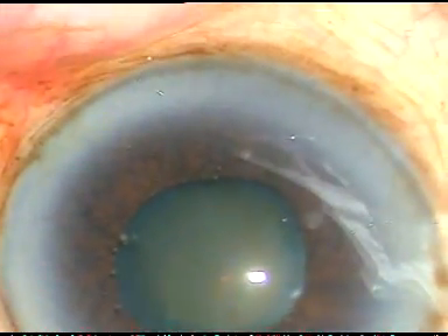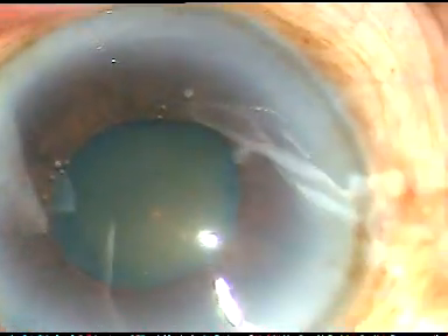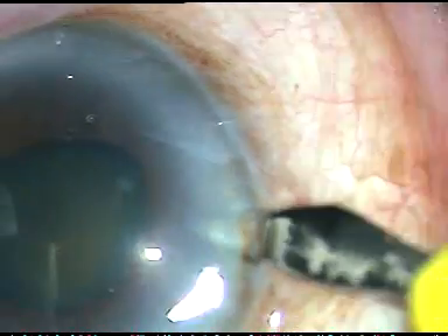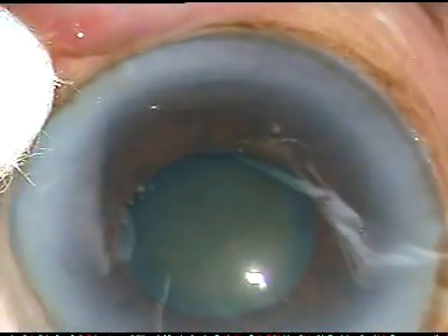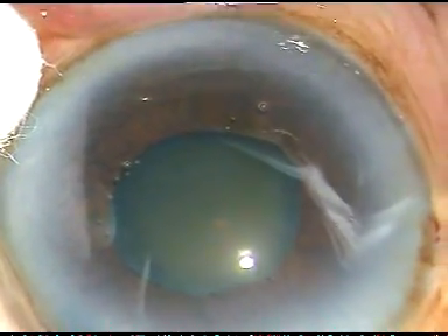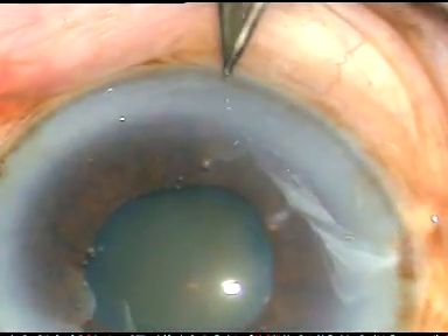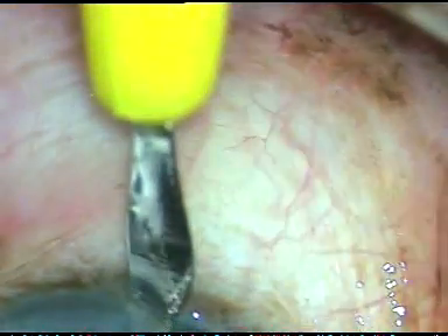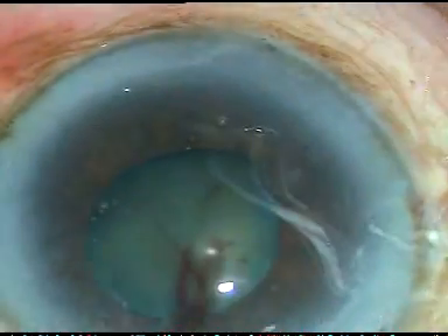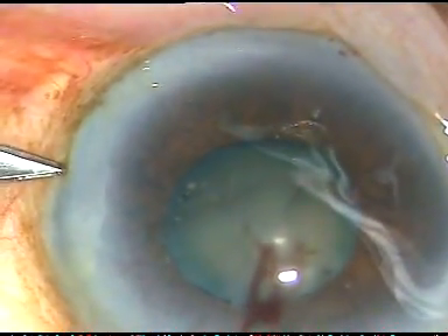Now I have decided to make some stab incisions and apply iris hooks as the pupil expansion device in this case. This is the first stab incision at 9:30, the second at 12:30, the third at 6:30, and the last at 3:30. So, 4 stab incisions, 3 clock hours apart.